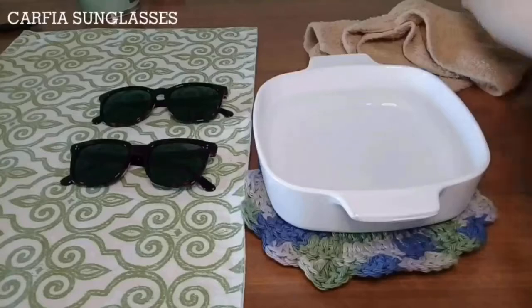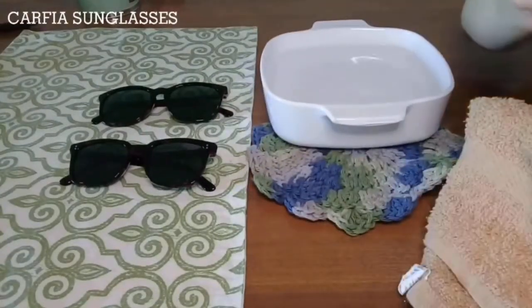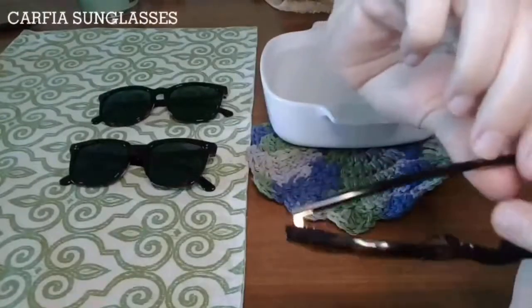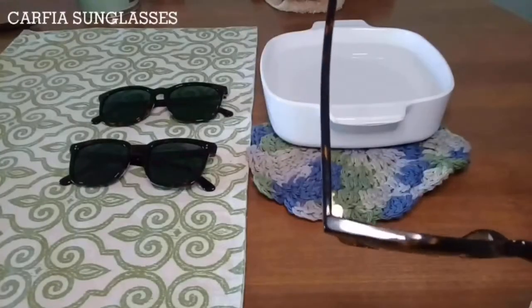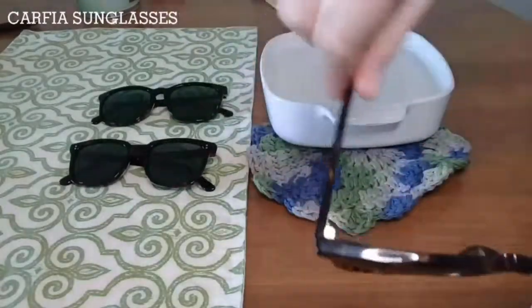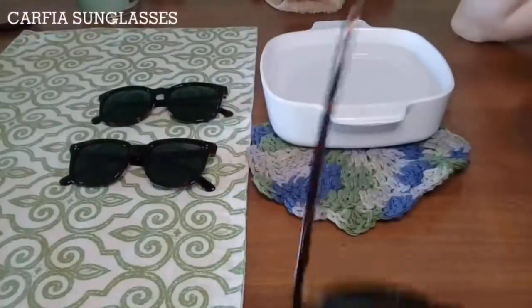So also a quick little thing, I want to talk about how I dry these just to make sure there's no moisture left in the hinge and that there's no rusting. First I'll take a towel and just dry it off like that, and then I will take this to the bathroom and use a hair dryer, and I'll hold it at every different angle. So I'll hold it like this and shoot it with a hair dryer, hold it out at a 90-degree angle and shoot it with a hair dryer, and then I'll just do that at various angles with the hair dryer to really dry up any moisture that's lingering. It'll help any moisture fall out and then evaporate as I go.